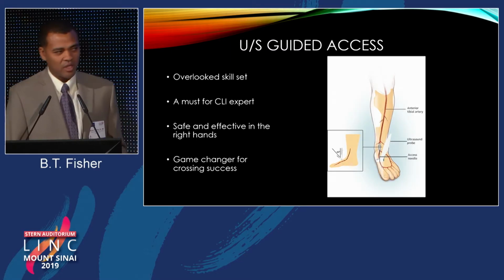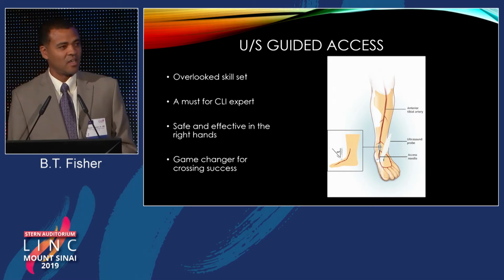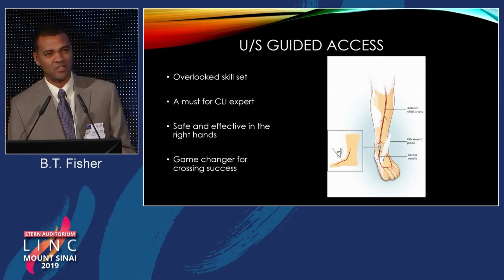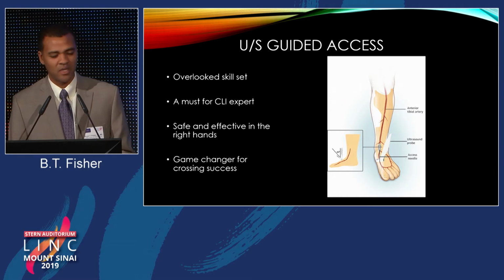So again, one of the other important points, and I think the key to being able to tackle these cases, is ultrasound guided access. I know seeing the cases in Europe throws us off a little bit, and again, that's a part of the training, being able to access under fluoroscopy. We try to stay away from that because of radiation exposure, and then again, with ultrasound guidance, you can essentially access any vessel that we use in the periphery, from radial to pedal access. Again, it's an overlooked skill set.